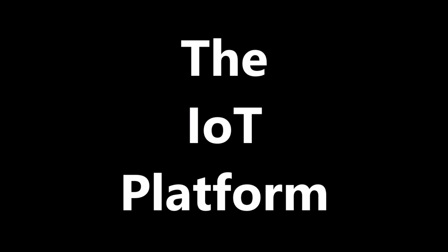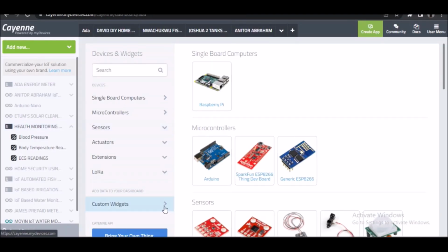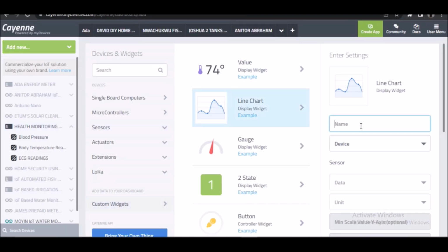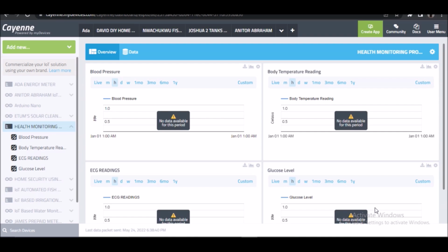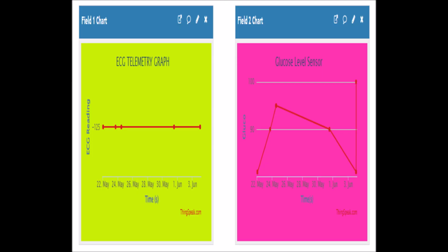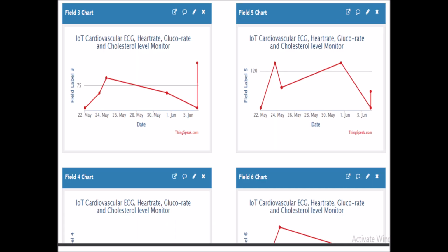Now it is time for us to send this measured data to an IoT dashboard. At first, we tried using the Cayenne IoT dashboard, but after setting up the dashboard, we found some inconsistencies and left it for the ThingSpeak web server. The ThingSpeak telemetry provided us with the right avenue to quickly set up the IoT monitoring and remote analysis of the cardiovascular reports measured by the sensors, and that is it.